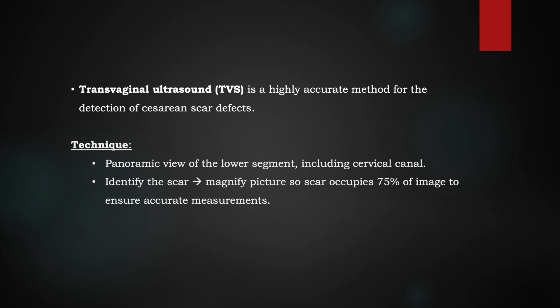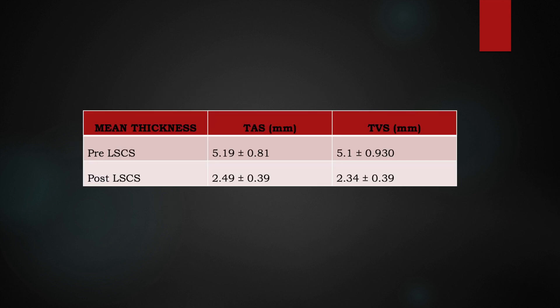Transvaginal ultrasound gives a more accurate measurement because we can see the scar beautifully and the anatomy is appreciated optimally. For this, we take a panoramic view of the entire cervical canal from the internal os to the external os, then magnify it such that the scar occupies more than 75% of the image. The mean thickness of the lower uterine segment in pre- and post-LSCS shows a small variation between transabdominal and transvaginal scans.